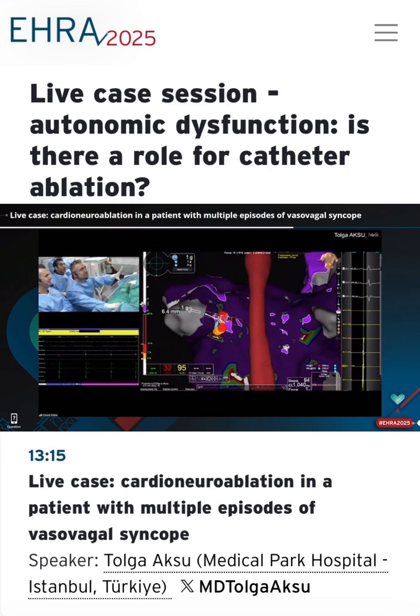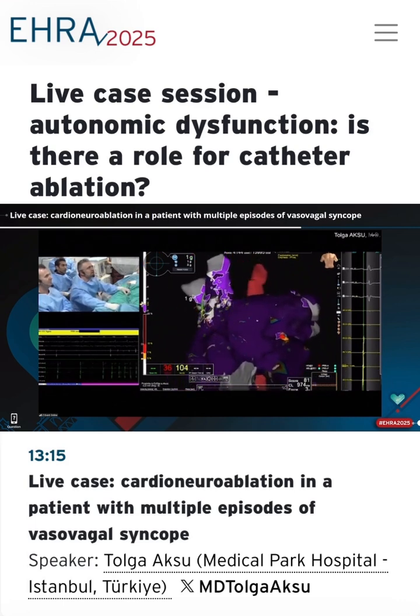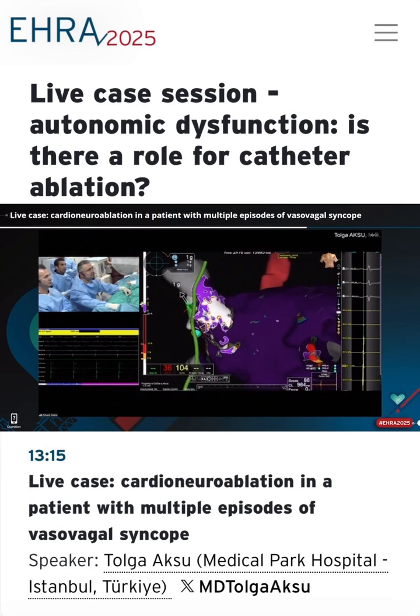So we just see a decrease from 60 BPM to 50 BPM heart rate. In the second or third RF application, I didn't see any bradycardia. We eliminated the electrogram, so I will move to right superior GP. Heart rate is still 60 BPM level. Can you remove the right atrial map? Yes. The white site shows fragmented electrogram and peak frequency higher than 600 Hertz. And please add CT GP.